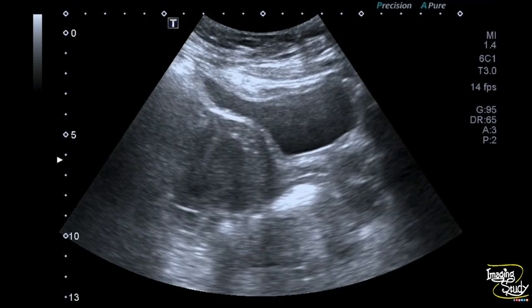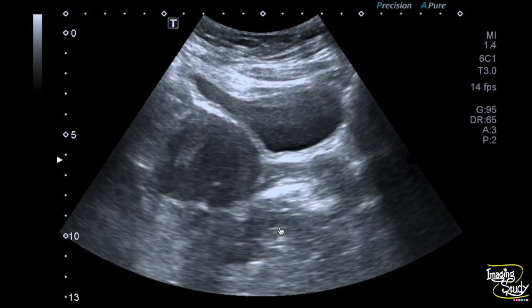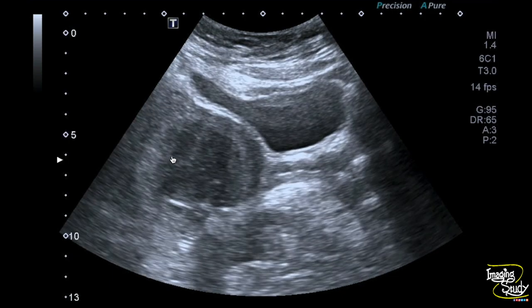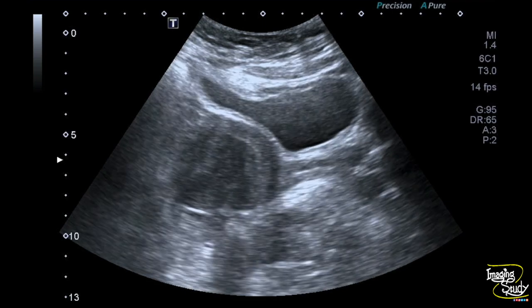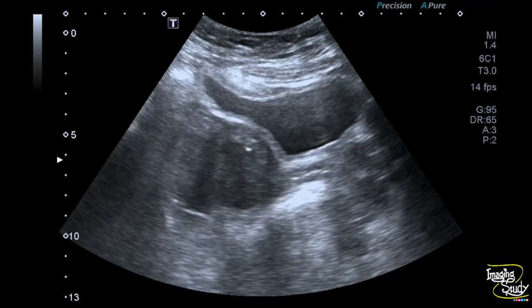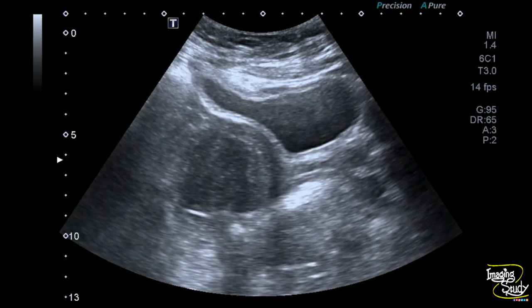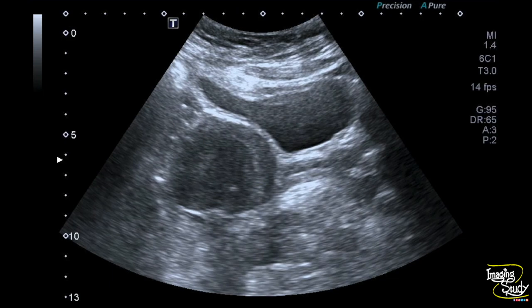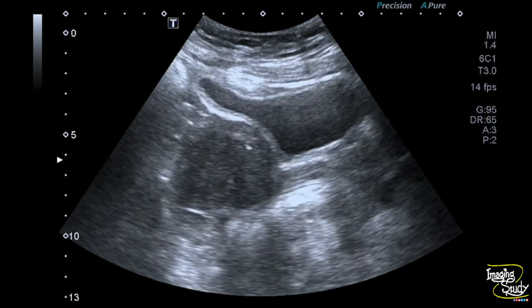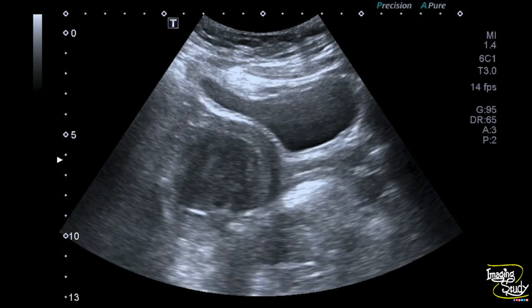If I freeze the image and try to draw, you can see this line is the endometrium, which suggests that this uterus is a retroflexed one. Sometimes this type of retroflexed uterus may cause confusion if you do trans-abdominal ultrasound, and commonly we mistake it as a fibroid. It is just a normal retroflexed uterus.